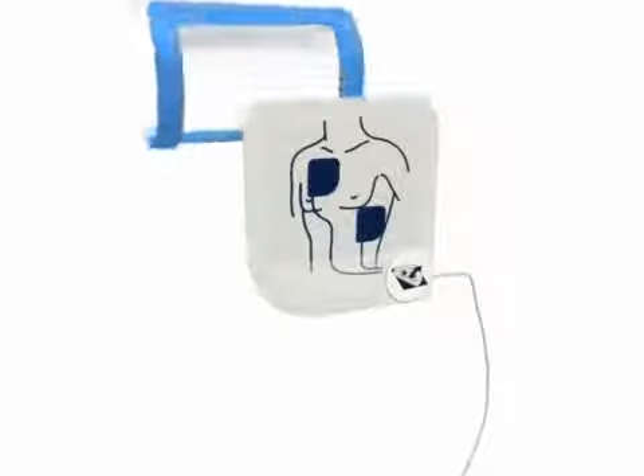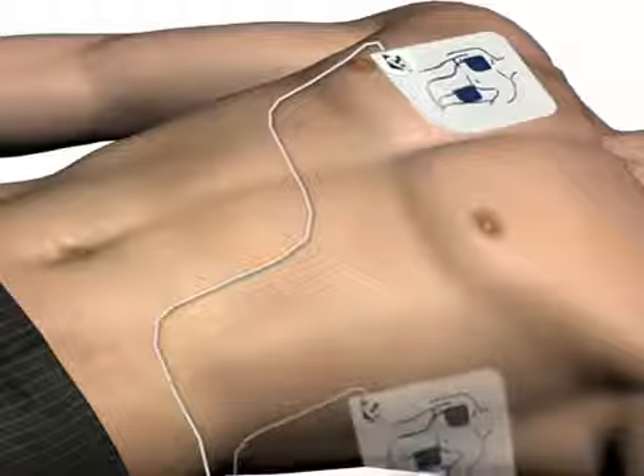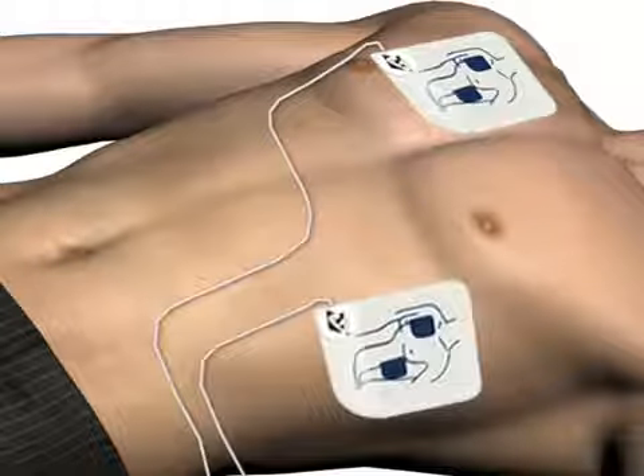Next, peel the blue plastic liner off of the second white pad. Firmly place the second pad on the opposite location exactly as illustrated.